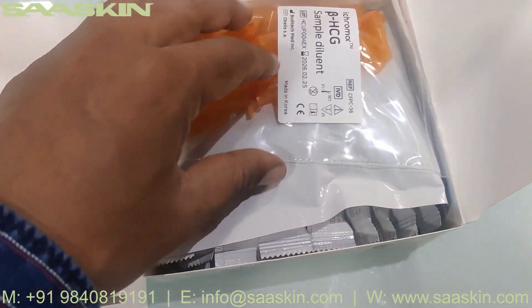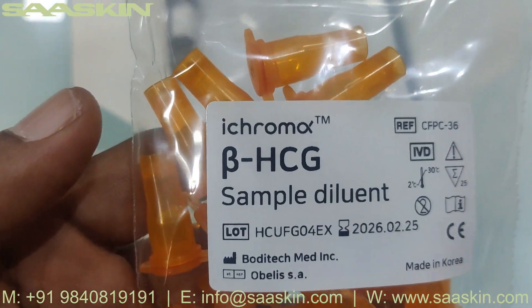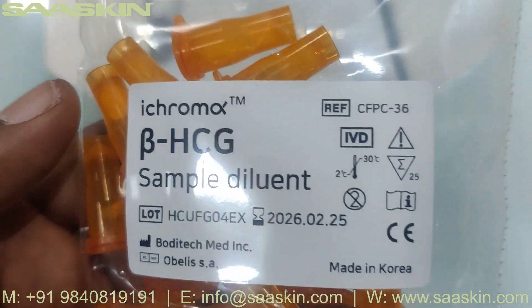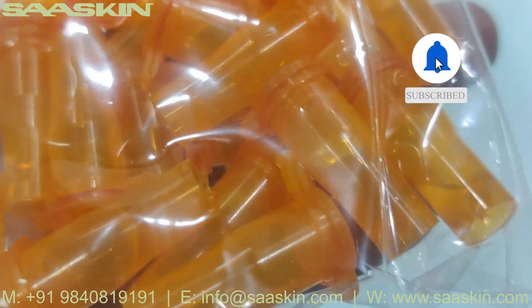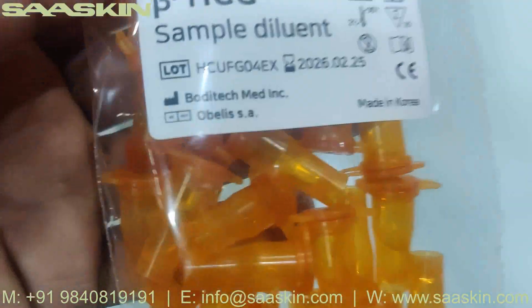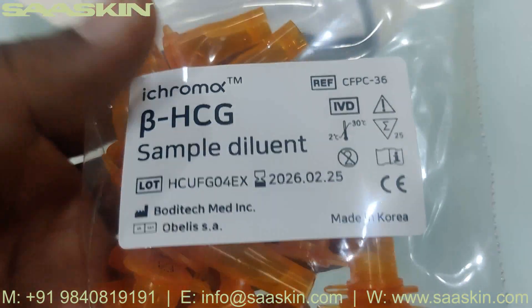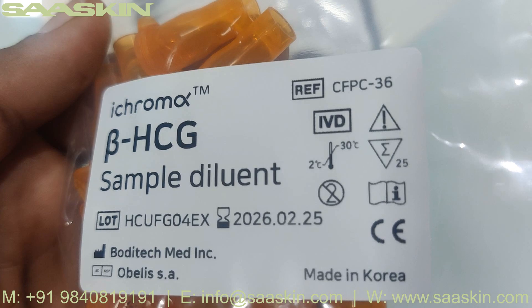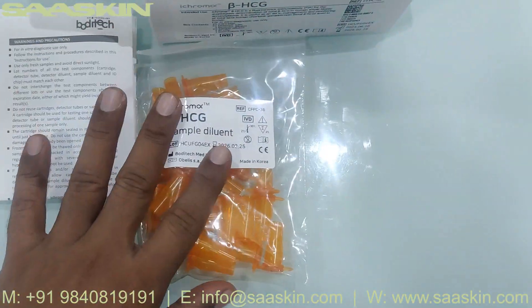Going inside the box, you can see there is iChroma Beta HCG sample diluent — 25 pieces. You can see the liquid inside the diluent. It says iChroma Beta HCG sample diluent, and the lot number and expiry date is given. Here you can see the individual liquid diluents inside.